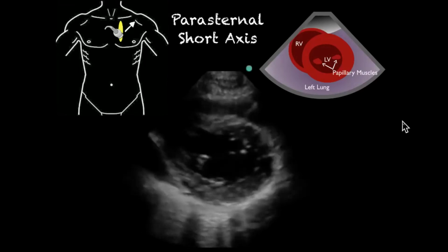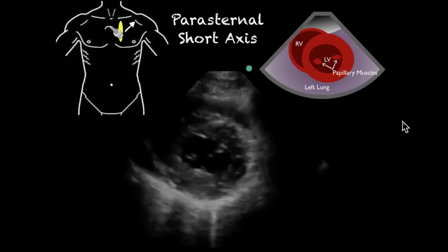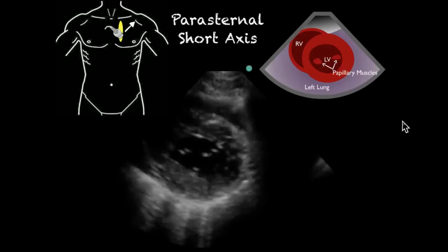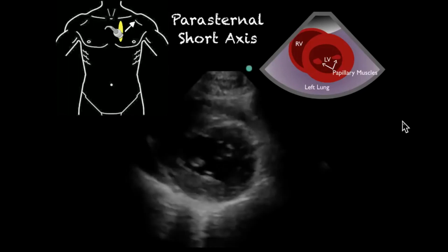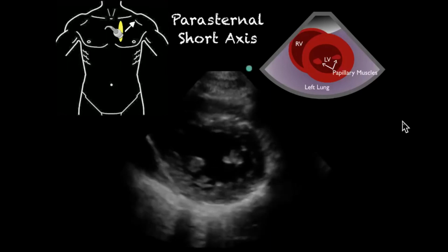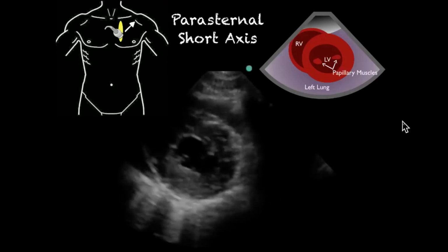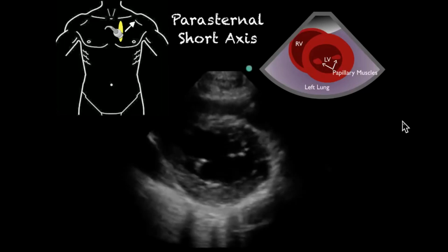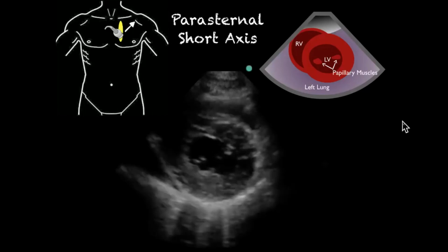and what is going on with that, and how much collapse is there. Now, when you evaluate this, a lot of novice practitioners of ultrasound will say, well, it's not collapsing all the way. You have to remember that a normal ejection fraction is above 50%. It does not have to collapse all the way. If those walls are touching each other, that's a hyperdynamic heart, and that's not normal. We want to see that space decrease by 50%.